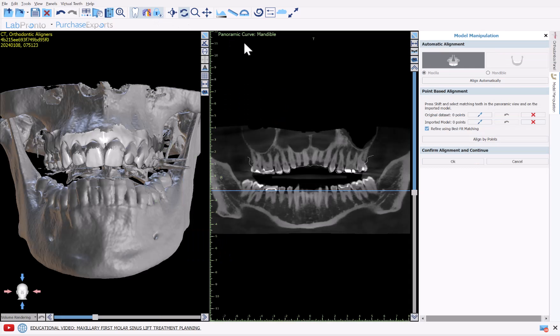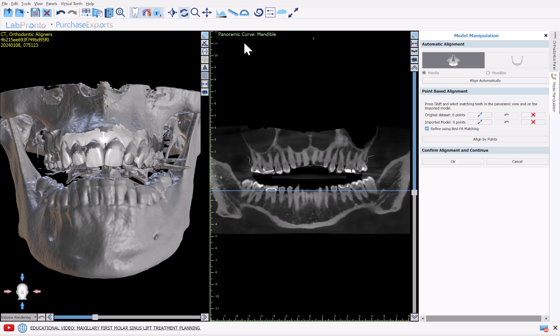The software has now taken us to this point where we're confirming the alignment between the optical scan and the CT scan. So just to reiterate, besides selecting the relevant data sets, the software has run through the segmentation processes automatically. We'll see the results in just a minute.